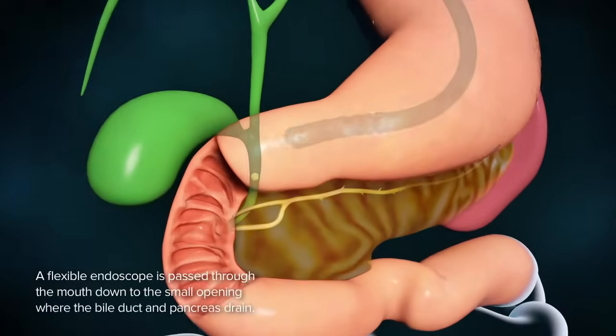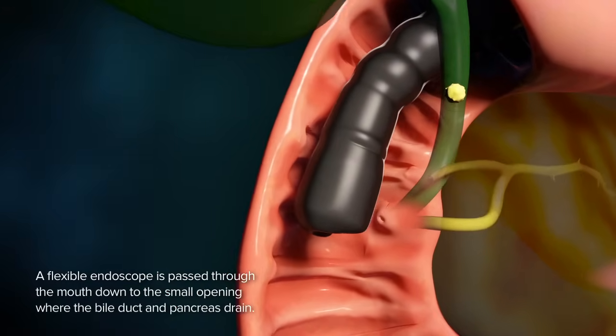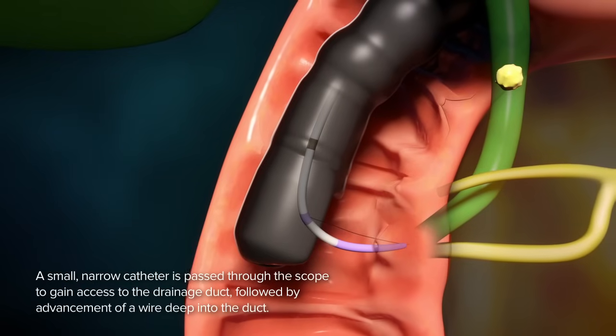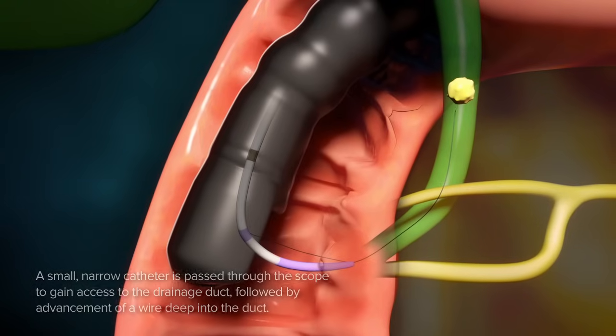A flexible endoscope is passed through the mouth down to the small opening where the bile duct and pancreas drain. A small, narrow catheter is passed through the scope to gain access to the drainage duct, followed by advancement of a wire deep into the duct.